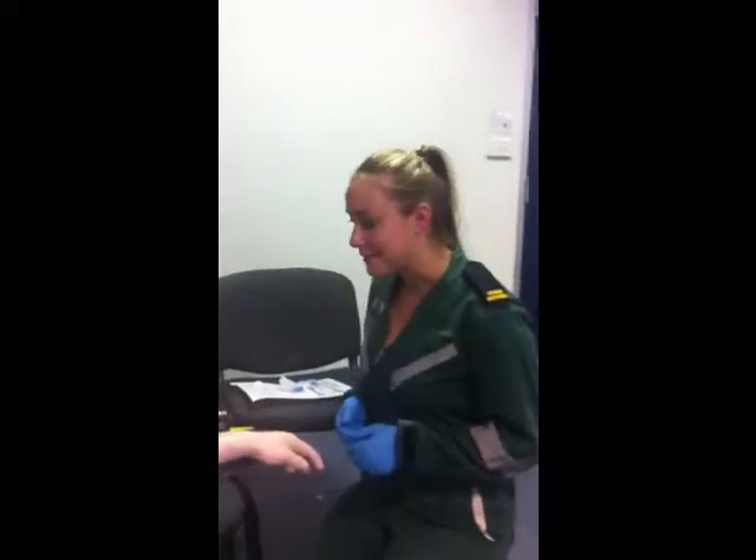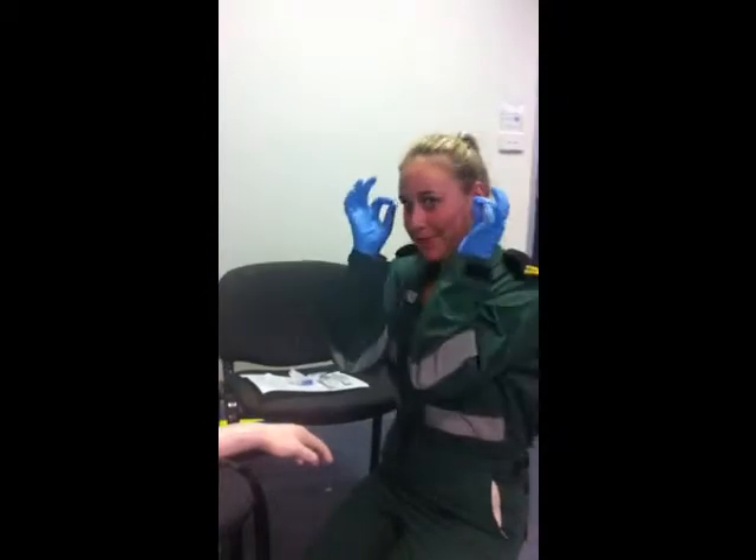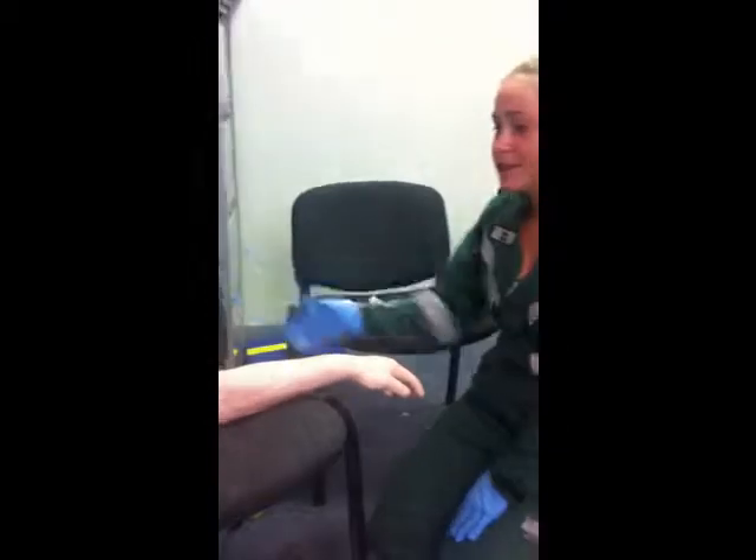First time I was contemplating, this is how it goes. So gloves, I have goggles on. So the patient is seated.